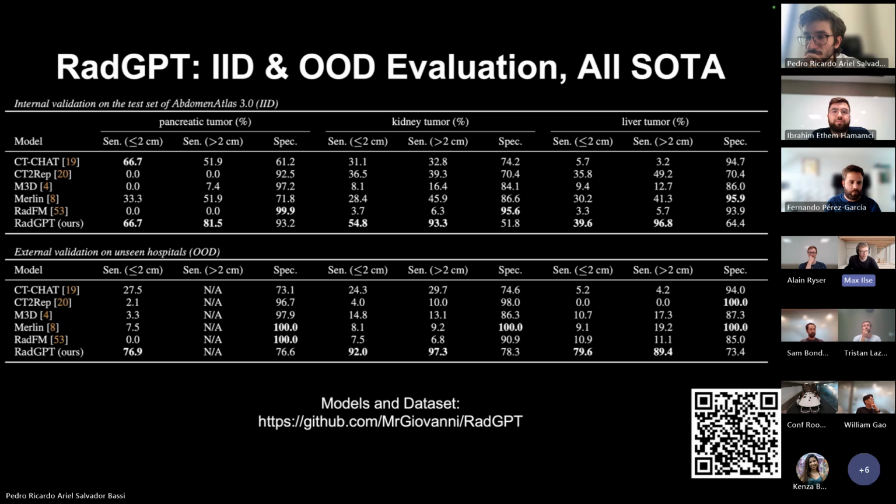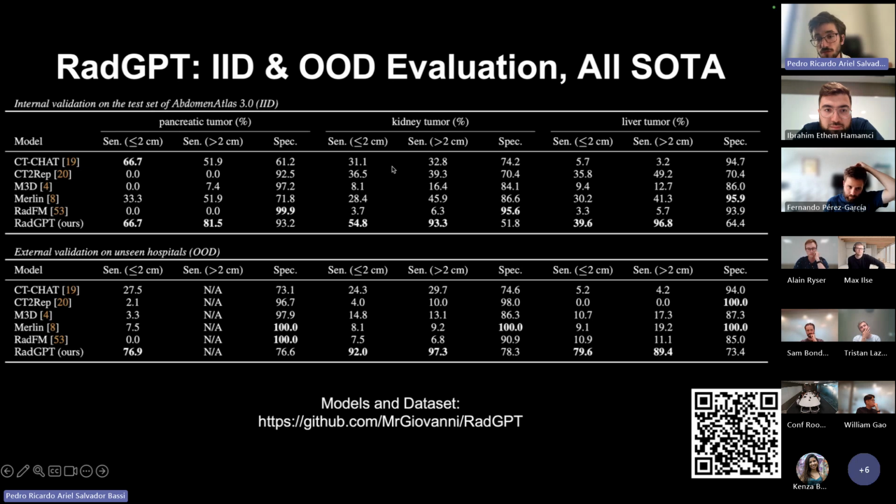Yeah, you showed this table and then you said that the segmentation models generalize, and you probably mean something very specific by saying that, but I was not sure what you mean in this context. So by generalize, I mean this first test dataset comes from the same sources as the training datasets. So it's the same data distribution as the training dataset.